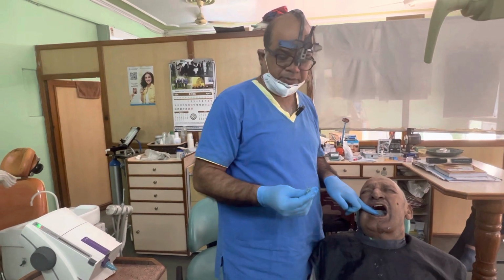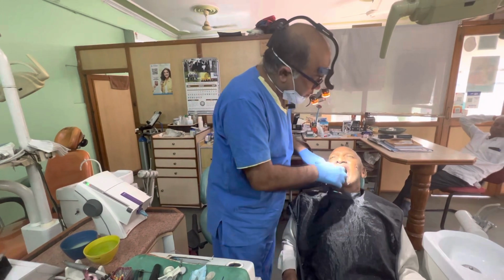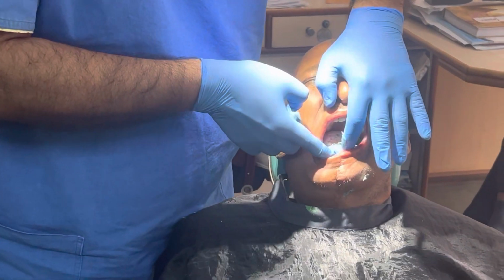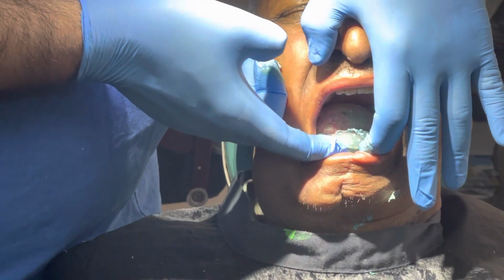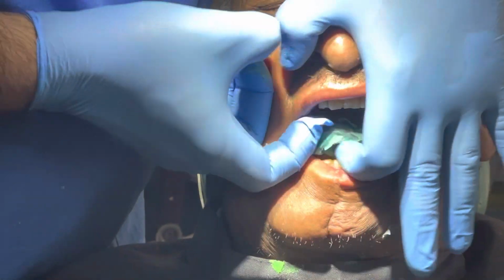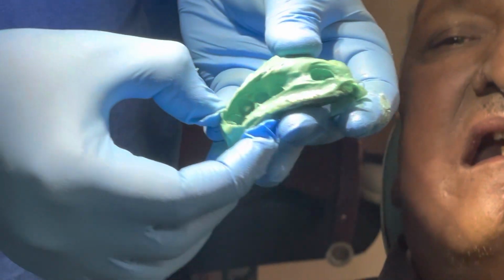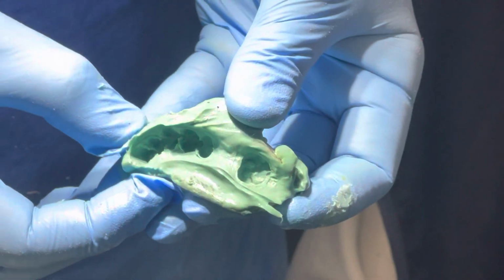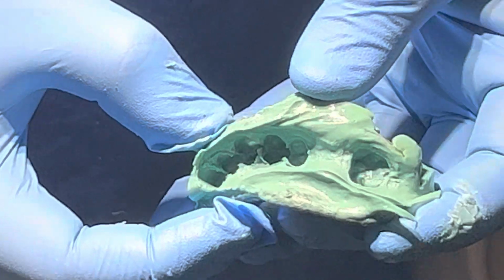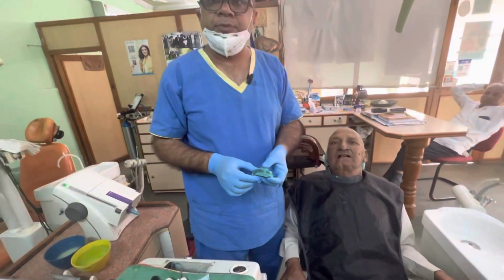See, I have seen that this impression is getting set. You have to remove it very gently. The beauty about this material, polyether, is that it has very good rigidity. So you can easily remove this. You can see the impression has nicely captured the entire area. So thank you guys. Thank you very much.